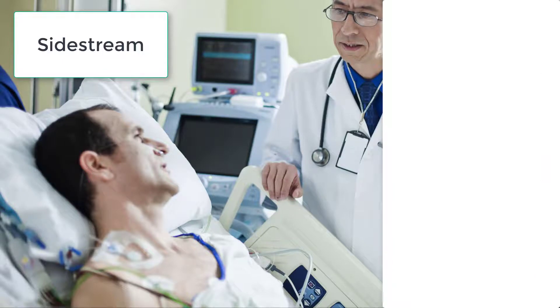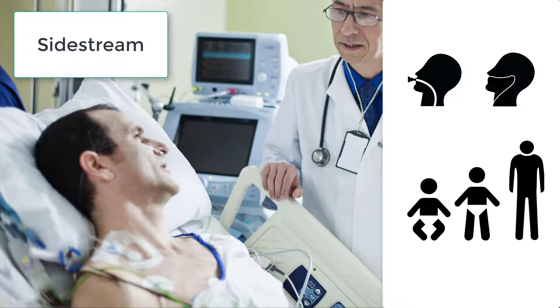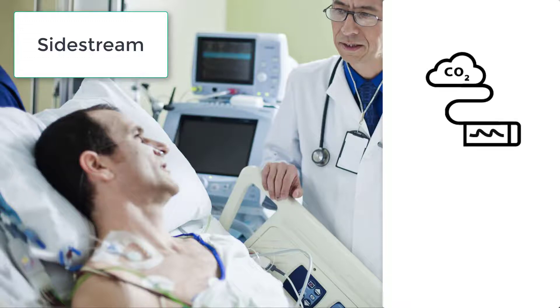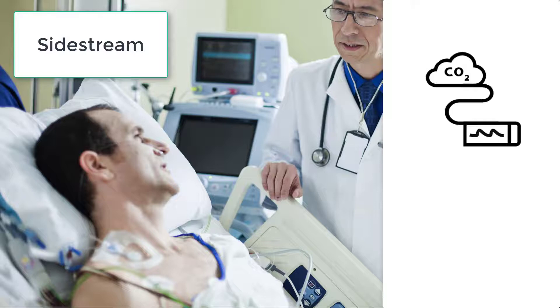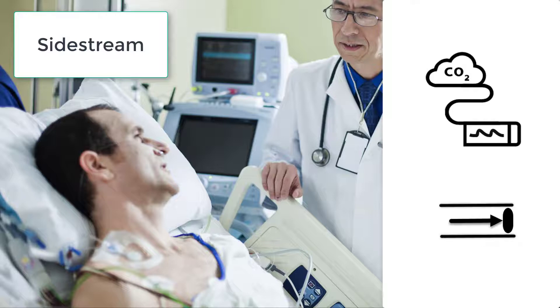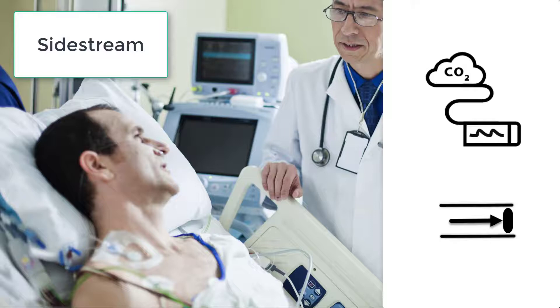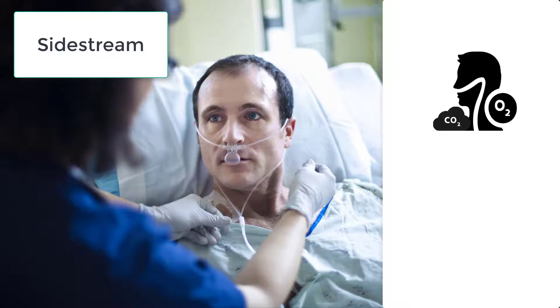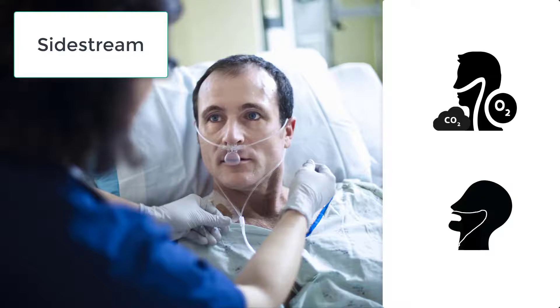All three sidestream solutions are fit for intubated and non-intubated patients, and can be used for adult, pediatric, and neonatal patients in almost any patient position. There is a minimal delay in the waveform and readout because it takes time for the gas sample to travel to the sensor. Secretions can be aspirated into the sample line, causing the line to occlude and requiring user intervention. There are many options when selecting an appropriate cannula for non-intubated patients — for example, combining CO2 measurement with administering oxygen, or using an oral-nasal cannula for a patient prone to mouth breathing.